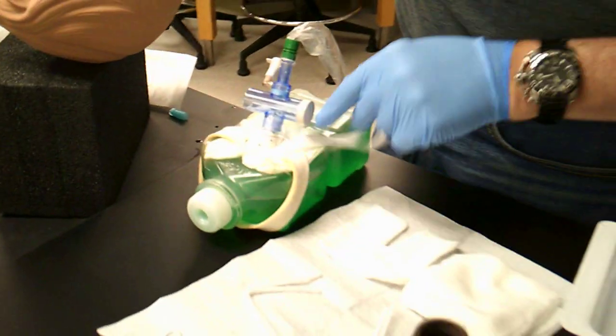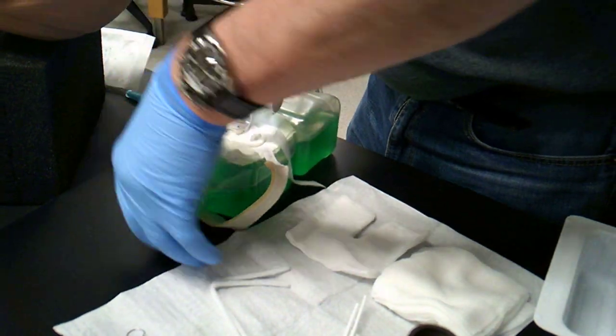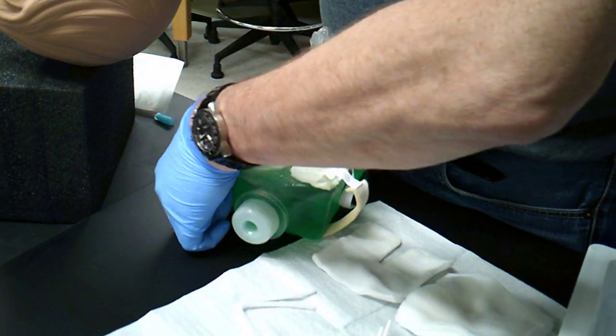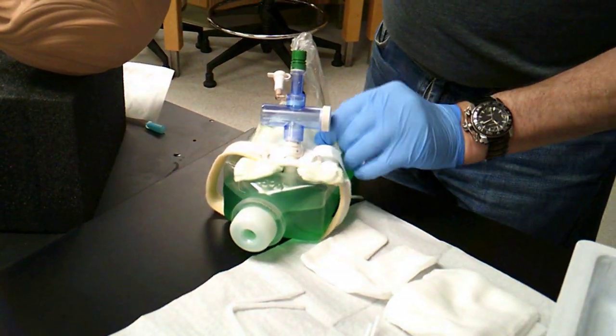So, when you loosen these, make sure that you don't loosen them such that the trach itself might slip out. I'm going to remove the old dressing.